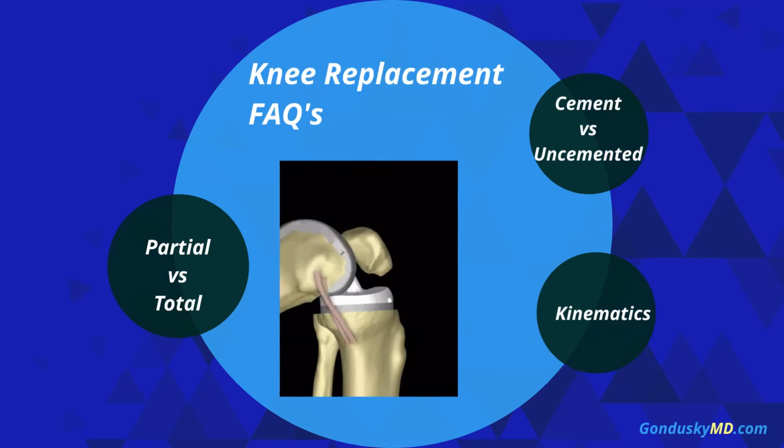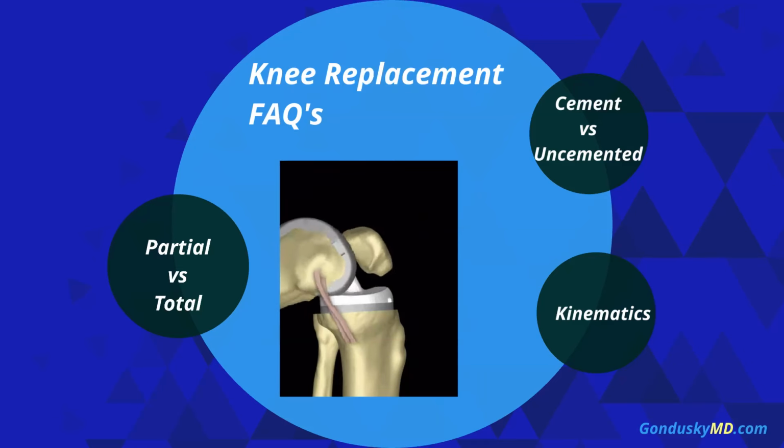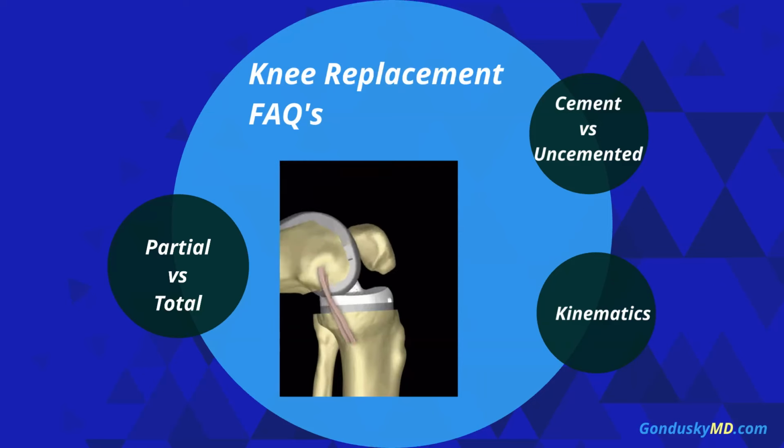So let's talk about frequently asked questions with knee replacement, of which there's a lot. These are not all of them, not exhaustive, but at least hopefully this will give you an idea to answer some questions about knee replacement.